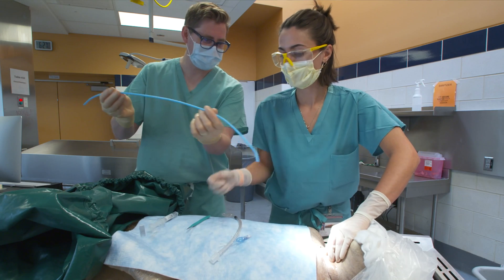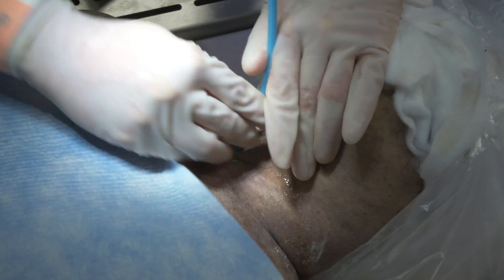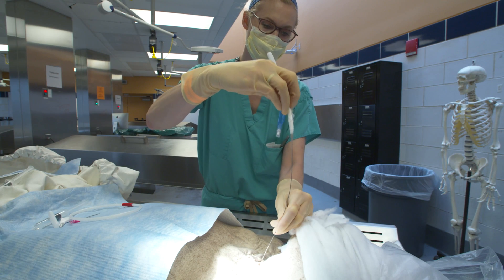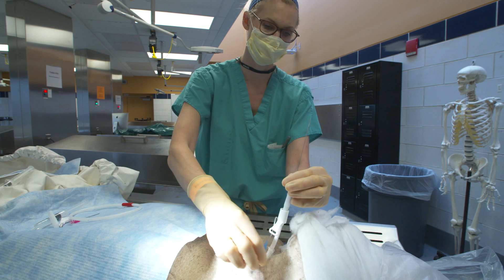We are in our anatomy lab today to demonstrate on human cadavers the technique of emergent cricothyroidotomy. This demonstration is geared to the non-surgeon group of providers who are infrequently but importantly called upon to perform this life-saving procedure when emergent airway access is needed but can't be achieved through the oral or nasal approach.